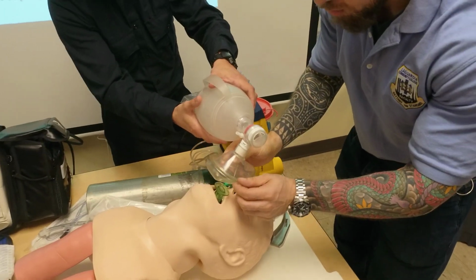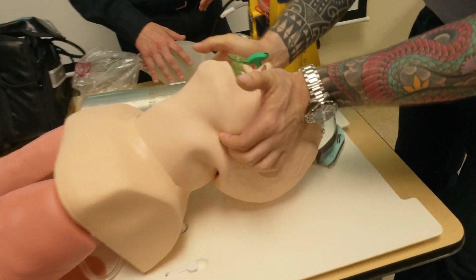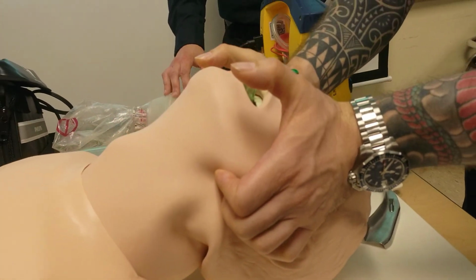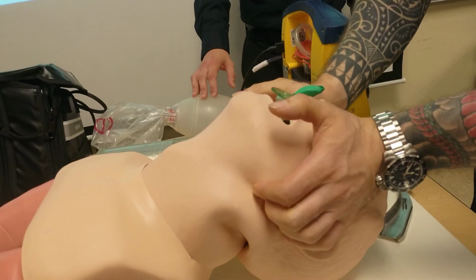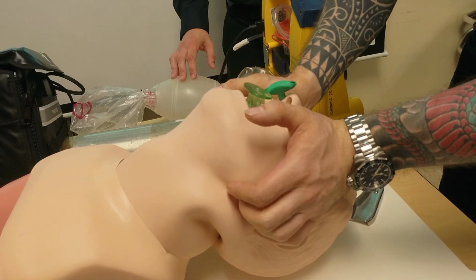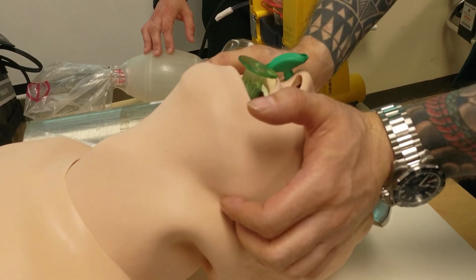I'm just going to show you the same procedure without the mask on. You find the ascending ramus and lift the mandible. You see what I'm doing? This is the jaw thrust. You open the mouth and extend the head over the atlanto-occipital joint. You're going to do this for 2 minutes. For this skill, if you don't do this for 2 minutes with the proper procedure, it's going to be a critical failure. We're going to practice doing it so you do it right.